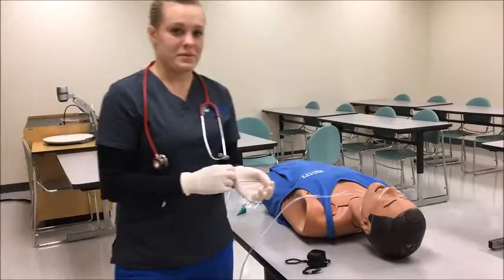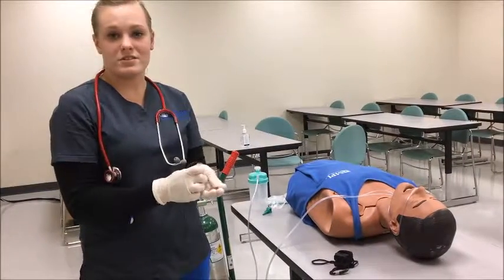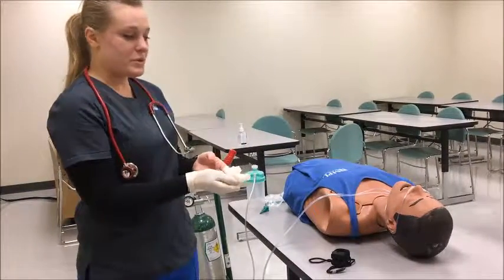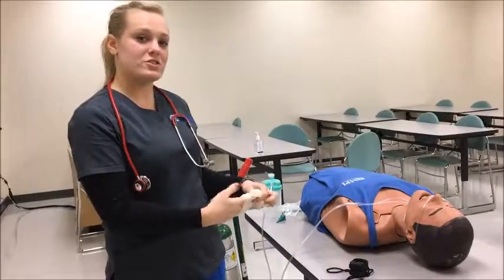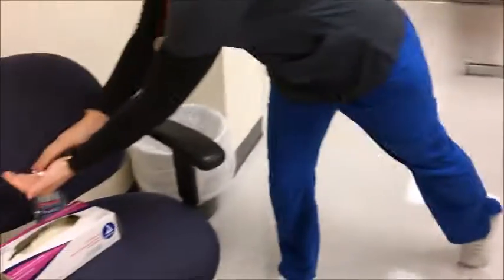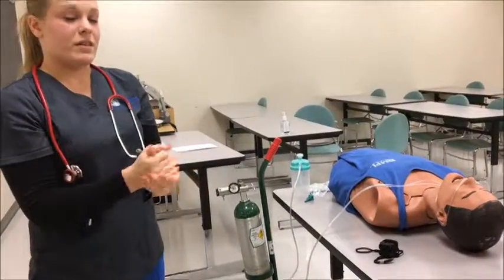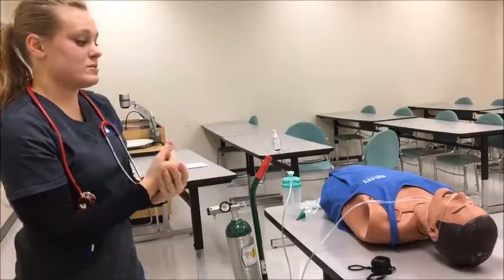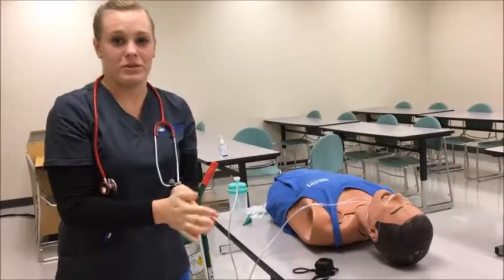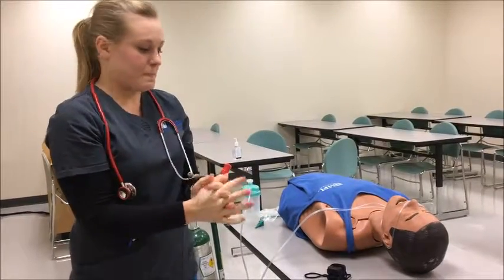And now I'm going to decontaminate my hands, taking off my gloves, throwing them away, and putting hand sanitizer on again. And while I'm doing this, Mr. Smith here had a question about potential complications with COPD. COPD patients live with higher CO2 levels, so we would not be able to put them on too much oxygen because it could be very hazardous to them.